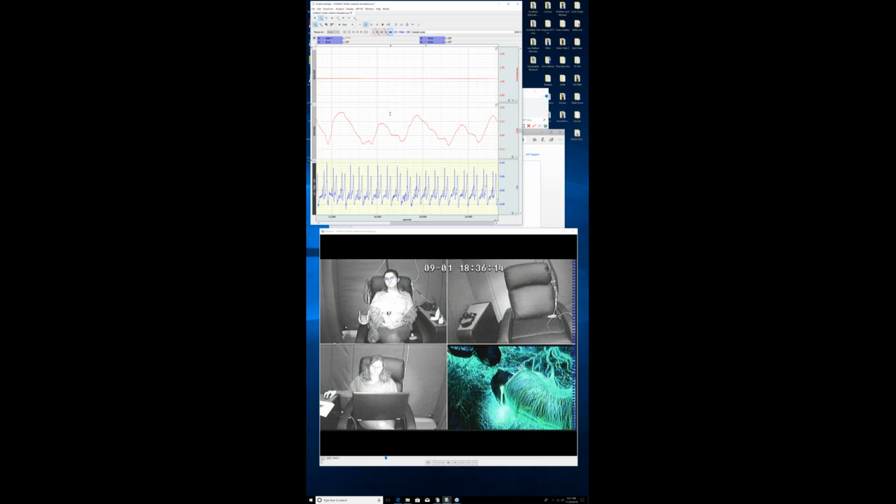So one option is that the BioHarness has a transmitter with an accelerometer built into it. And as I showed with the logger, the accelerometer can be used to pick up information. So if you have the participant in front of the video and you shake the actual BioHarness strap and review the X, Y, and Z, you'll pick up the point where the accelerometer changed very rapidly in the physiological data.